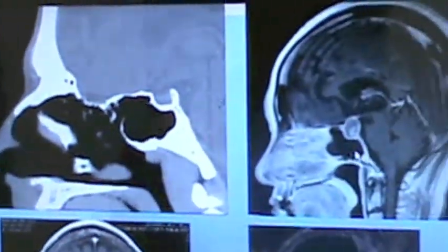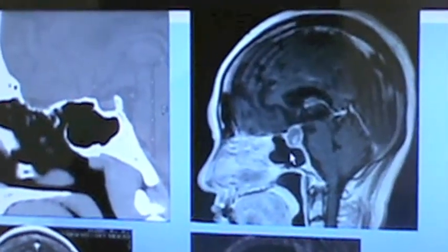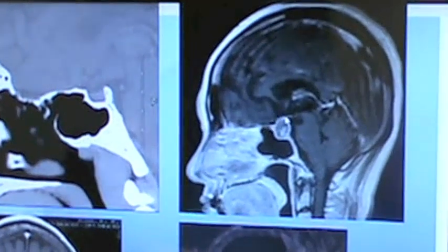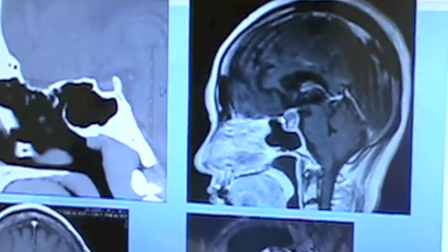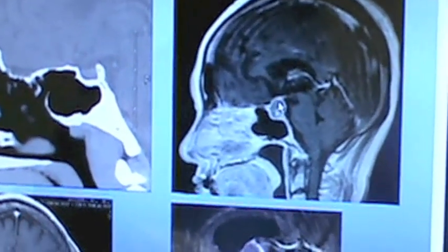And on this patient, here's the sphenoid sinus. There's a growth here that's fairly large.